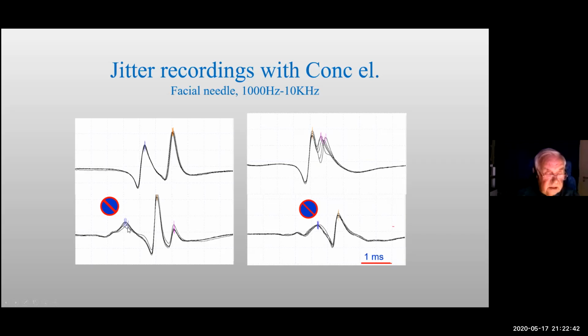And you see this is not parallel, and they are fluctuating very much, and this is not acceptable. This can be used. So we use a recording between 2 and 3 here. Here, they are not parallel at all if we look. So this must be a summation of more than one fiber. It is summation of 2, 3, 4 fibers here. So we skip this recording.